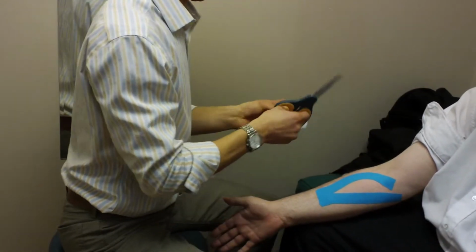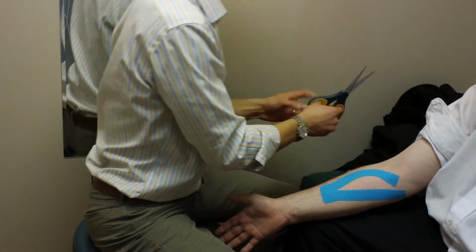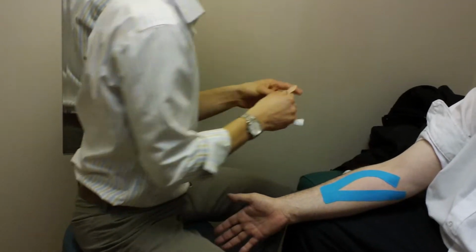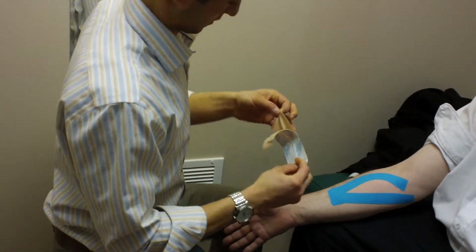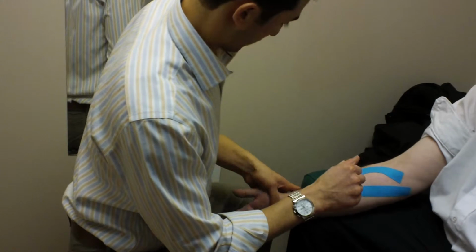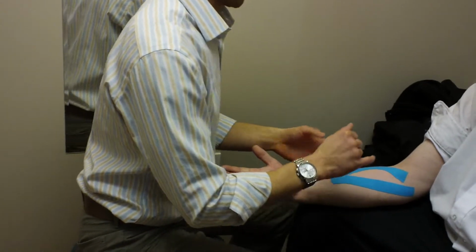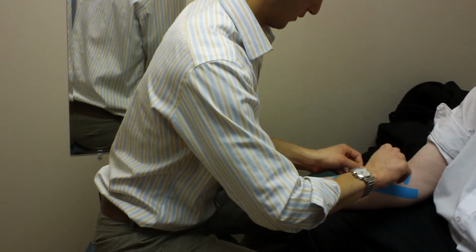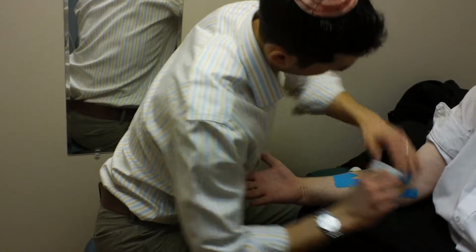Cut our tape. And again, we're going to use the classic Y pattern here. So remember, we're starting at the insertion of the muscle, which is right about here. And again, we're just going to take him about as far as he can go comfortably to stretch the muscle, which is right about there, right? Okay, so now he's in just about full supination, so we're stretching the muscle. We're going to put down the tape around the insertion, right about there, and do the same with the tape there.